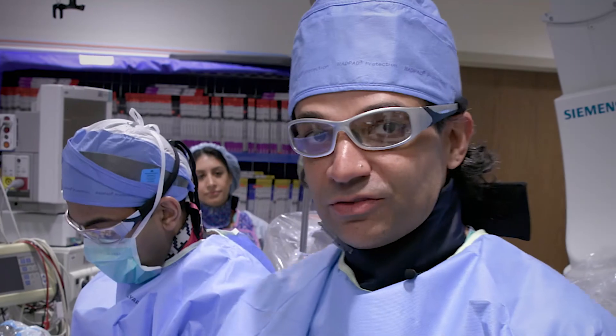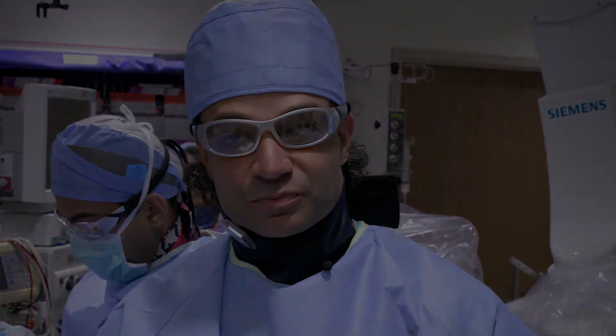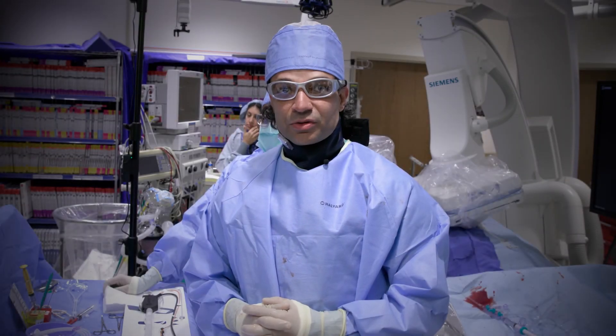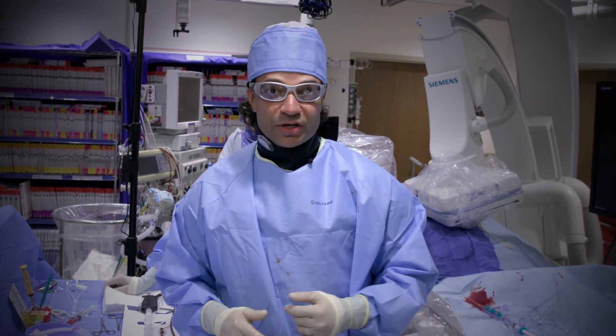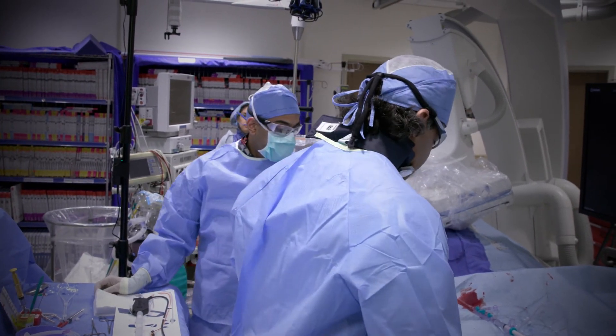So we have a great case for you here today. We have a 59-year-old female. She has a chronic total occlusion of the left SFA with three-vessel runoff. Let's go ahead and go to our angiogram.